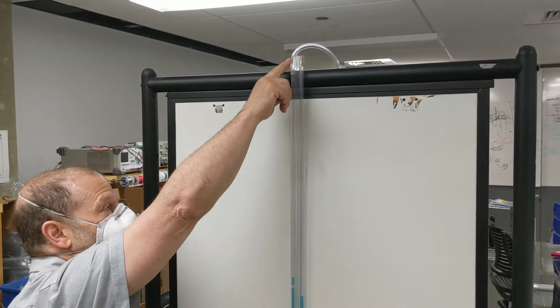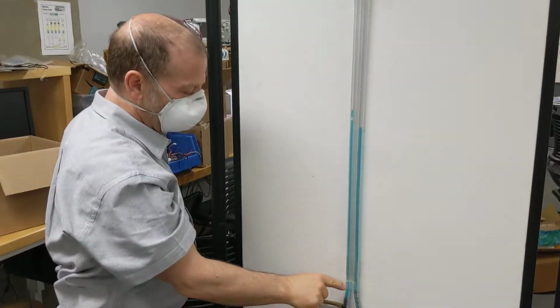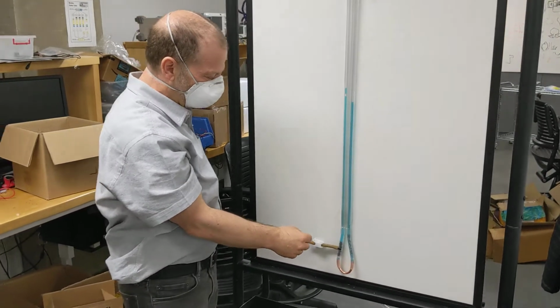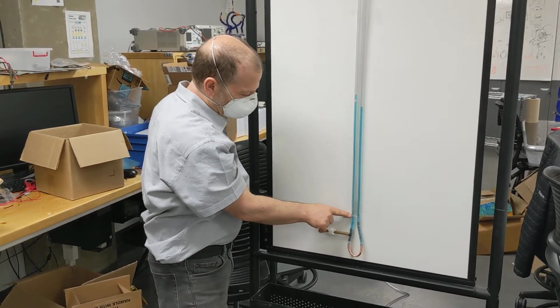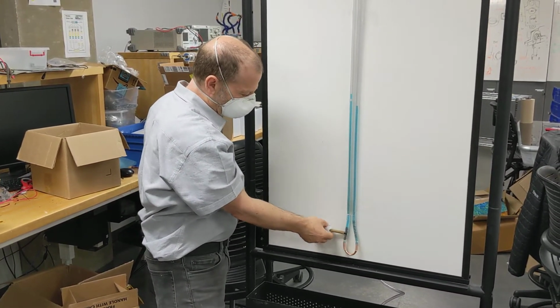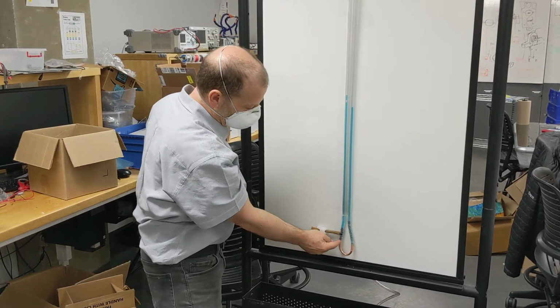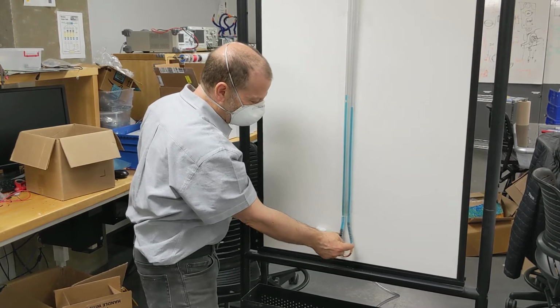Tube that comes from the pressure source to be measured. Two solid-walled tubes in this very convenient plastic holder. Piece of silicone tubing to couple it to a T. And a stopped-off silicone tube here for filling. Then there's a piece of copper to make that U down here.